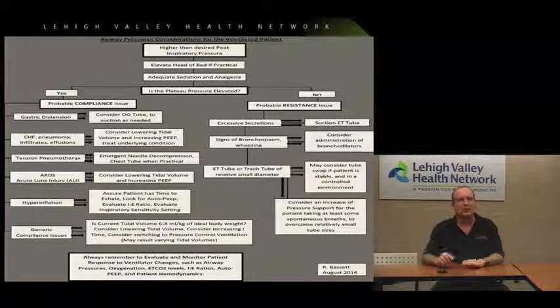And as usual, anytime you're making changes to your ventilator, of course we want to look at our patient, your end tidal, your oxygenation, make sure they're not auto-peeping. You want to check their hemodynamics, their blood pressure, their airway pressures, anytime you're making changes. Be careful to reevaluate, and continue to reevaluate during your trip. Things change, especially when moving patients around, especially in our environment. Things do change with these ventilator patients.